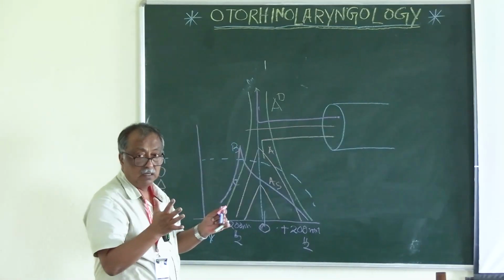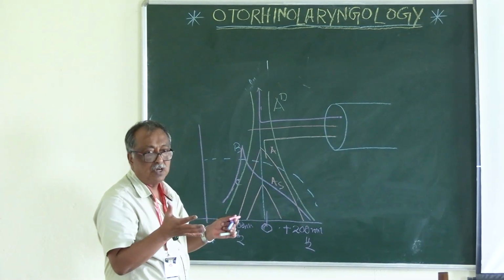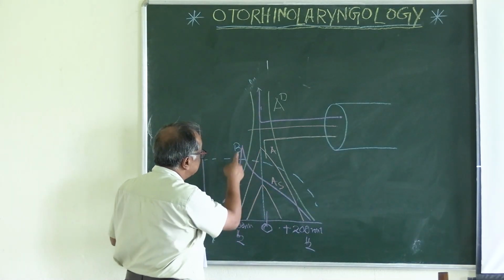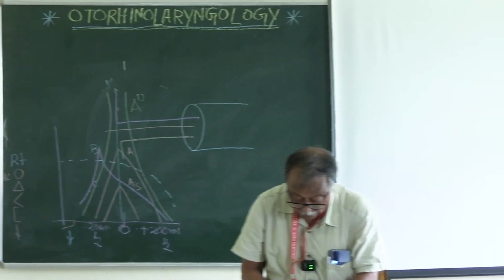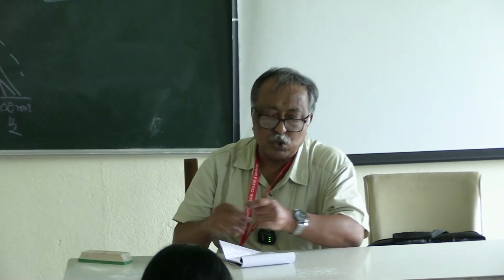This is due to the subluxation of the ossicular chain or maybe a thin drum. AD curve, A curve, AS curve, the C curve, the B curve. That is the impedance audiometry and it is an objective test. It does not require any personal response. So, we can combat the malingerers, we can assess the infants or the children by that.